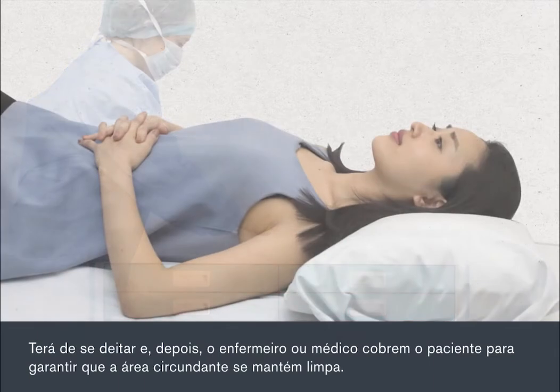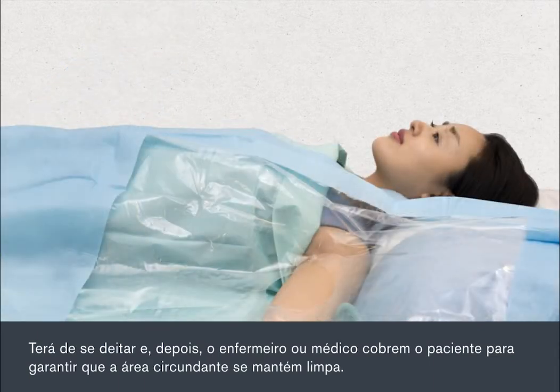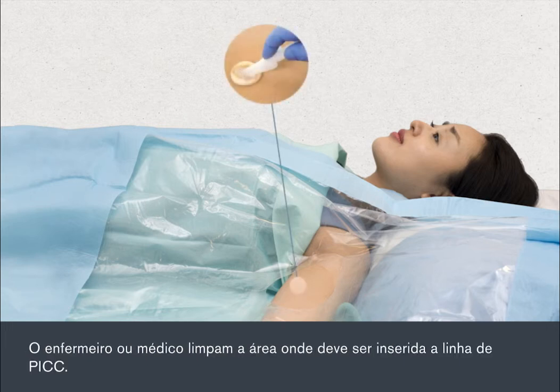You will need to lie down, and then the nurse or doctor will put drapes over you to make sure that the surrounding area is kept clean. You'll need to stretch out one arm to enable the PIC to be inserted. The nurse or doctor will clean the area where the PIC line is to be inserted.